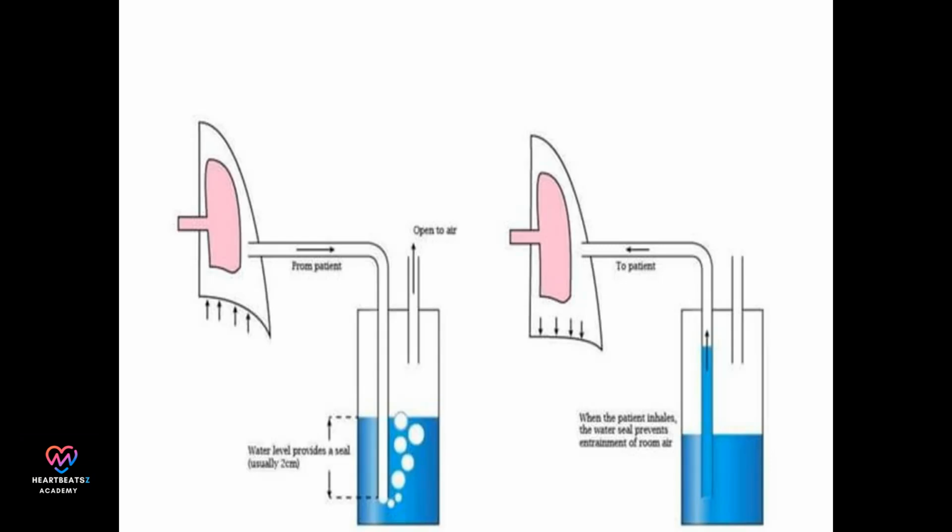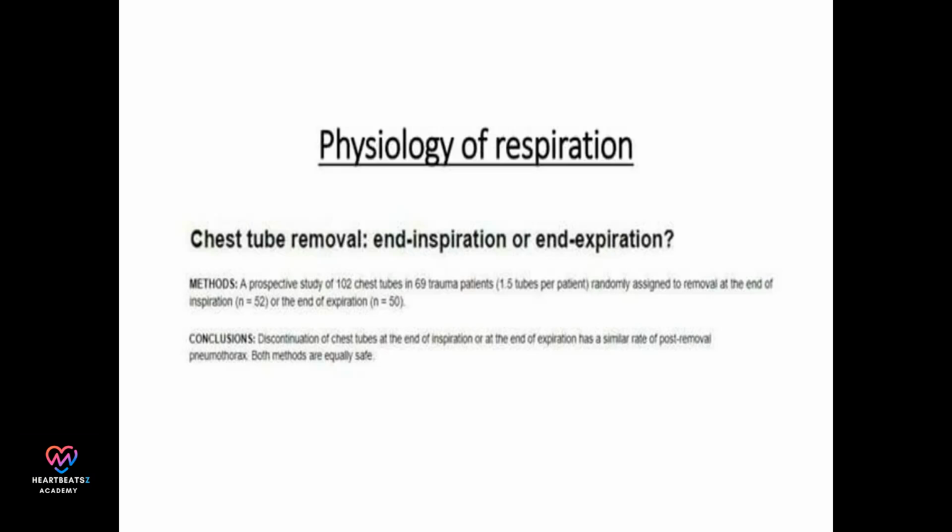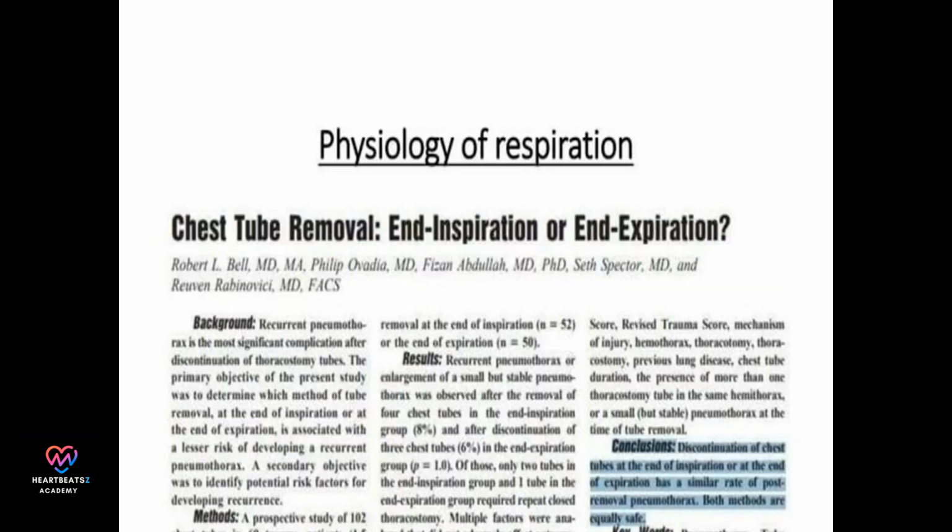Timing the removal of ICD at end inspiration or expiration reduces pneumothorax risk. This diagram shows a water-sealed drainage system used with ICD to prevent room air from entering. Studies show that chest tube removal at end inspiration or end expiration has similar rates of post-removal pneumothorax.